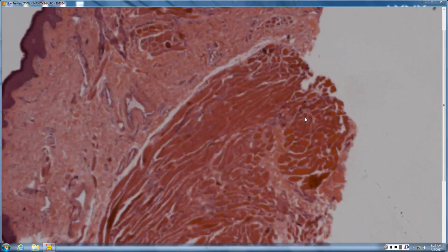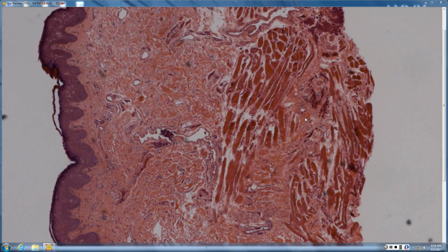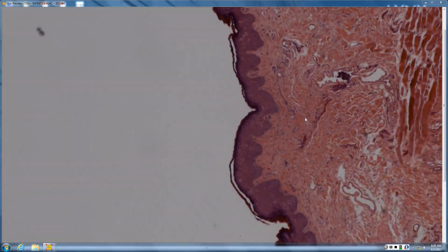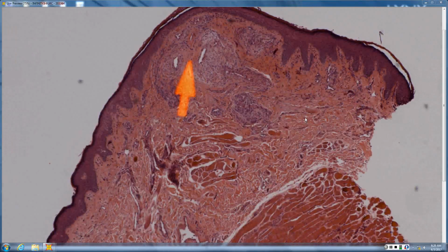Let's see. So there's some dilated vascular spaces in the dermis. And where do you... That's all muscle. That's muscle. And so it could be a lymphatic malformation that's kind of deep, kind of getting in within skeletal muscle. Yeah. If you just had these dilated, so an AVM given the thicker vessels, if you just had the thin-walled vessels, venous lake, some venous lakes may relate to a deeper AVM. Here you see pretty good thick-walled vessel. So a little AVM probably on a lip. Let's see what else we have here.